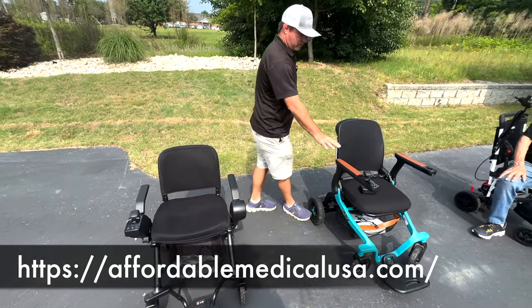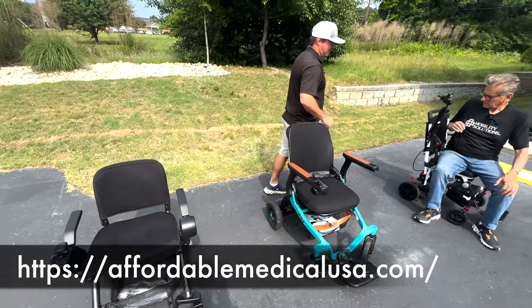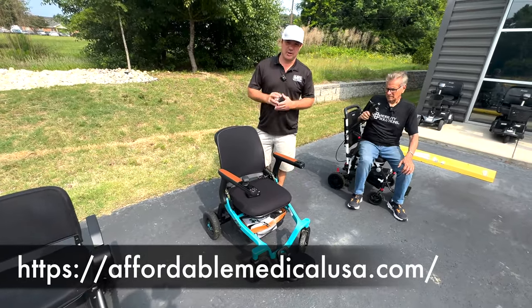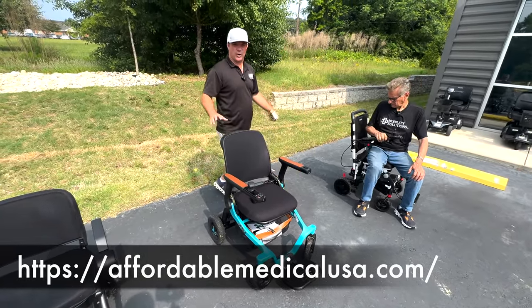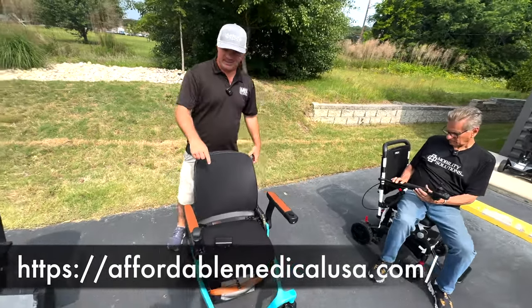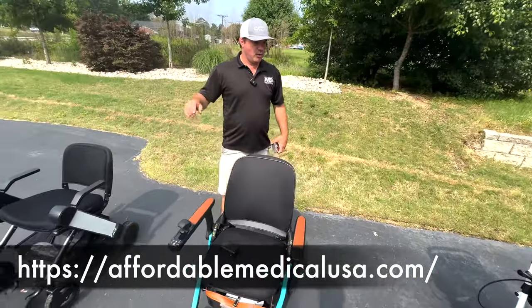You can increase this handlebar height with this one. This one's stationary, that one's stationary. This can be moved from right to left too. So if you're a left-hander, all these chairs could be moved over. The easiest one to move would be that one. This one would be second. This one would be third.